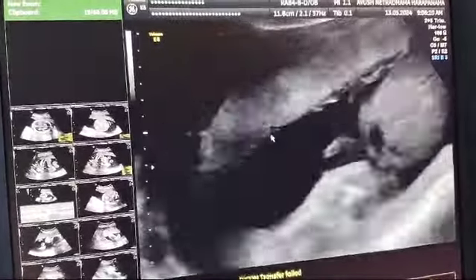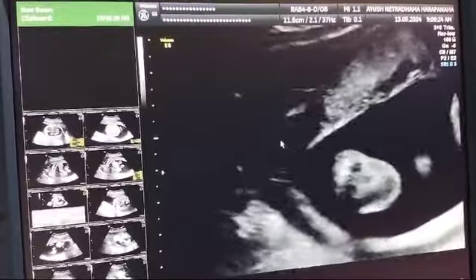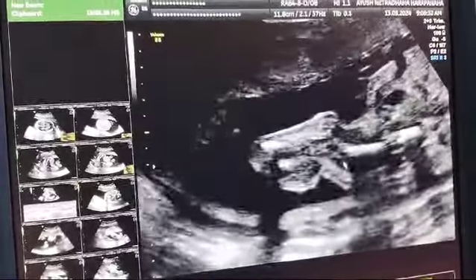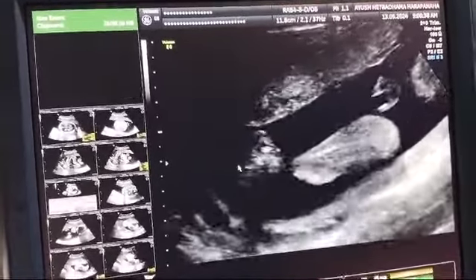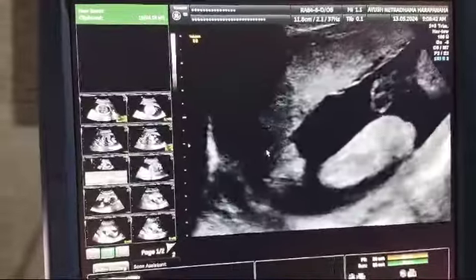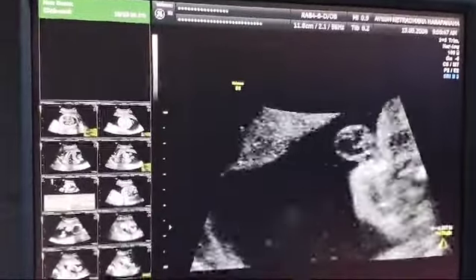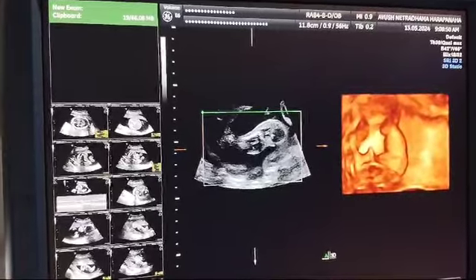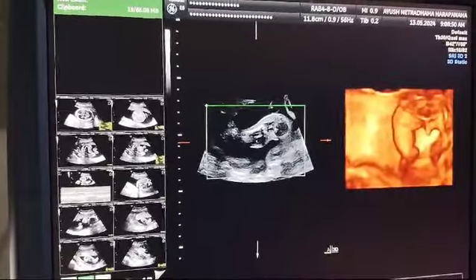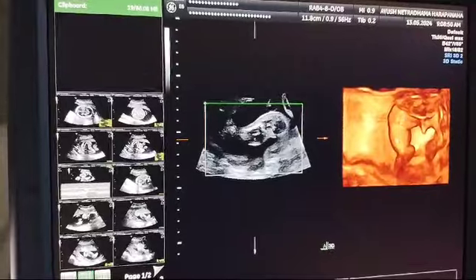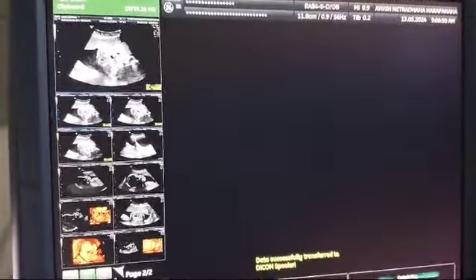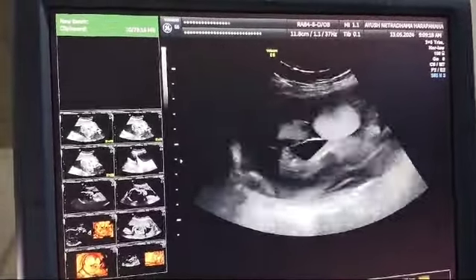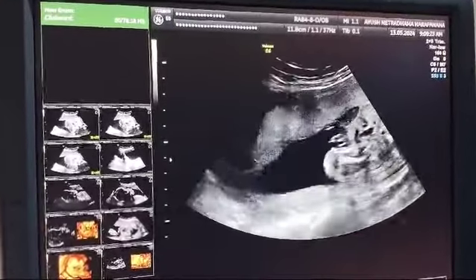When we look at the lower limbs, they again appear to have short bones. You can see a short femur, short tibia and fibula, and the foot which is stubby. The foot is stubby and very thick with soft tissue. Similarly, the other lower limb also has a stubby foot and thick soft tissue.